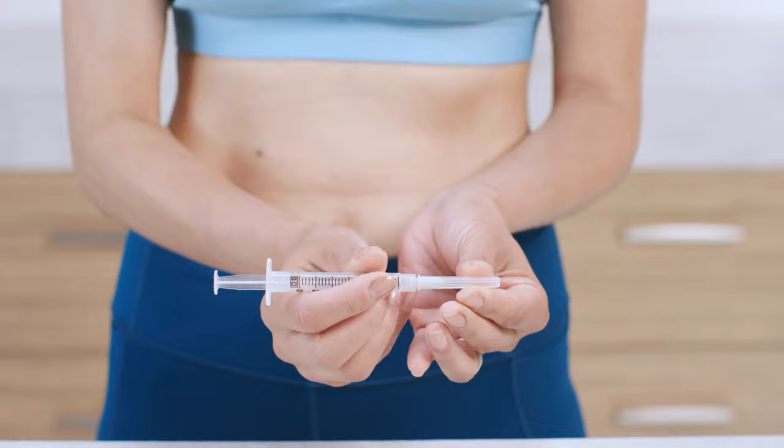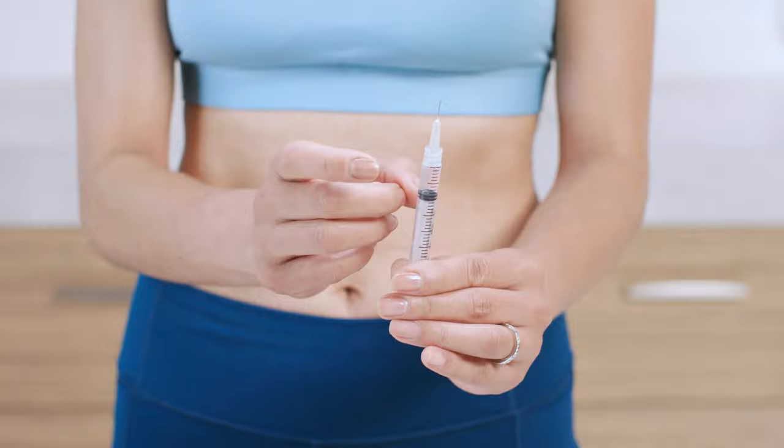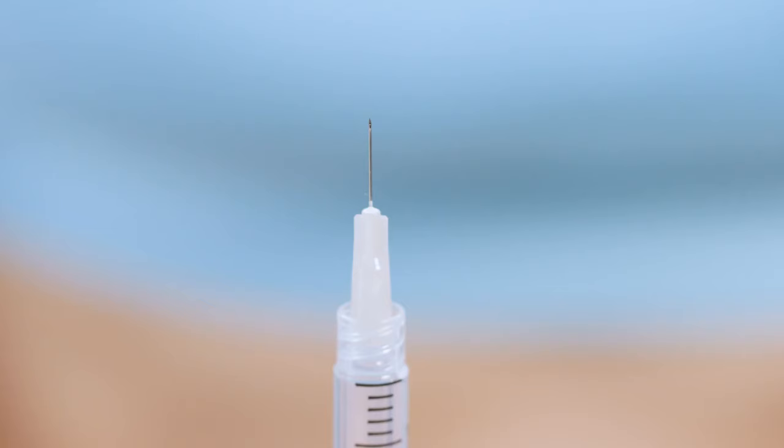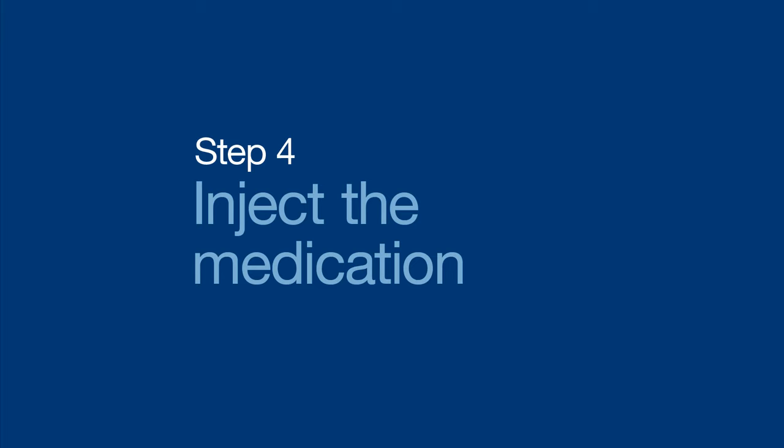Next, twist the injection needle onto the syringe and remove the cap. To get rid of any air bubbles, point the needle up and gently pull back on the plunger, or tap or flick the syringe until the bubbles rise to the top. Then press the plunger slightly until a tiny droplet of medication appears at the tip of the needle. A droplet is a good thing — it means your medication is ready to go.